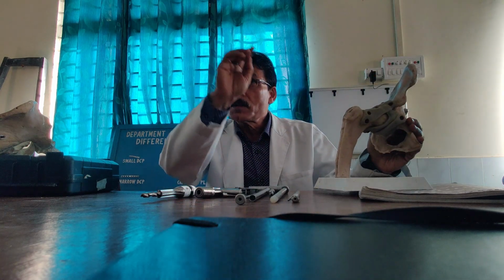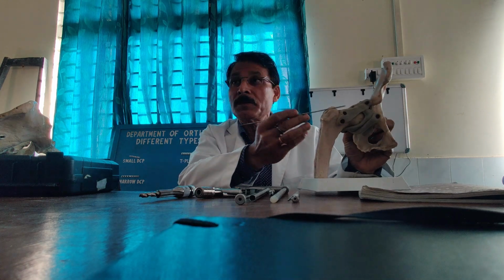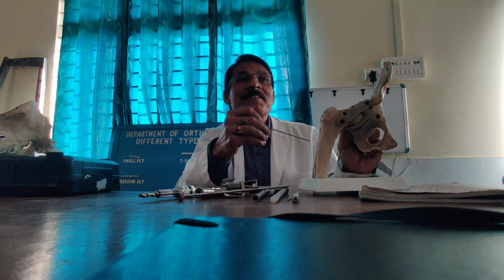What is bull's eye? Bull's eye means you are targeting the bull target. Then you have seen the target here, bull's eye. So your idea should be that the AP view is center, the lateral view is center in the head. So this is the idea. That is why people sometimes do not use this. Rather they wish to place the guide wire in the center, then you calculate it out.